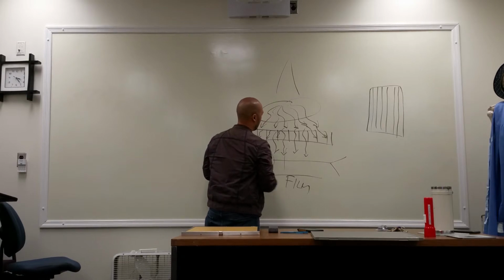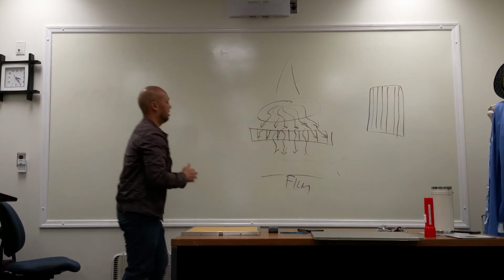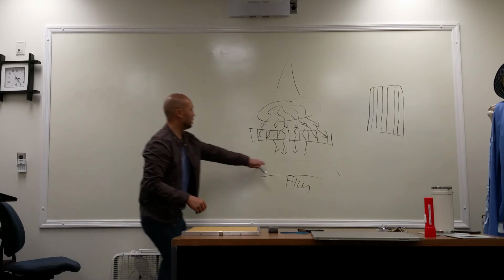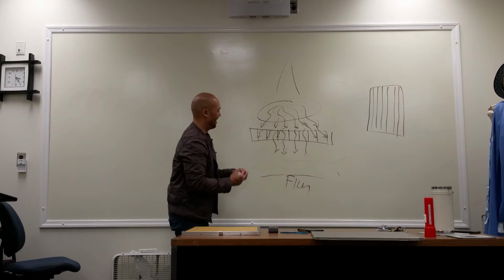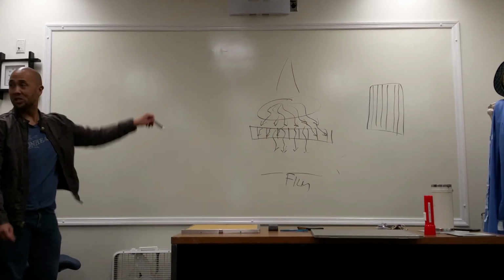So it just gives them like fine slots for the x-ray to go down, right? It's like a slot. So they're lead slots. That's so confusing. Didn't you say the patient was above it? Yeah, that's what I did. That's why I took him out. That's my patient right here. My film's down here. Yeah. So that's what's happening there.